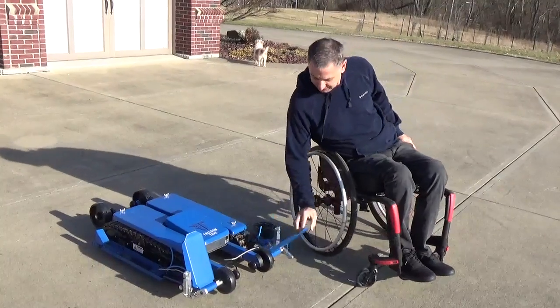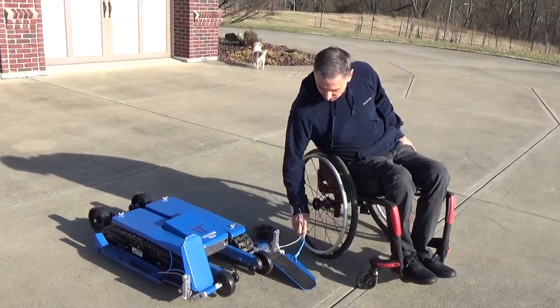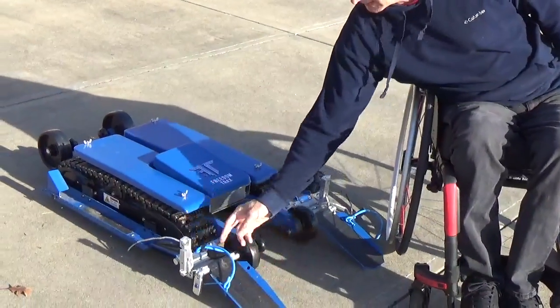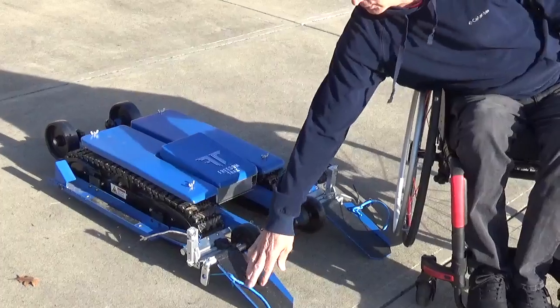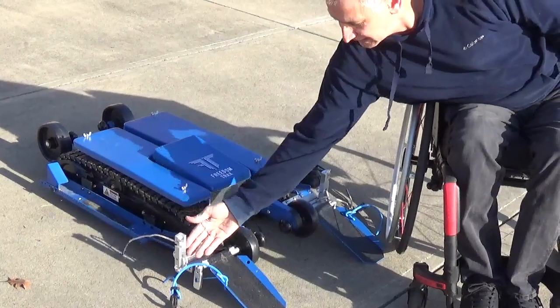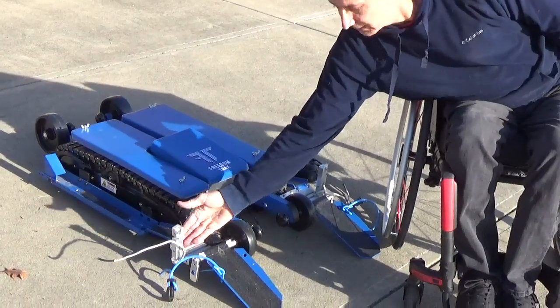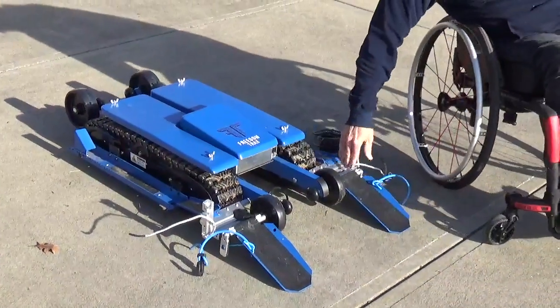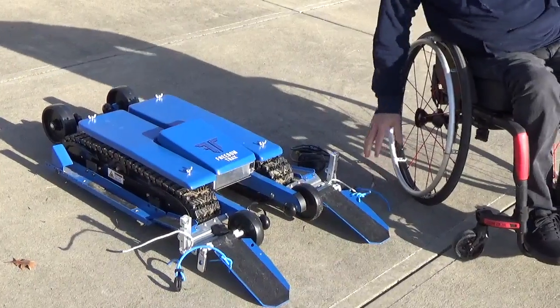Then just put the ramps down. The way you get on it is from the front to the rear, so you back onto it. I'll put these down and move the straps off to the side, and push these out the whole way, because this is what holds the front caster down. I'm going to push this off to the side and make sure everything is out of the way.